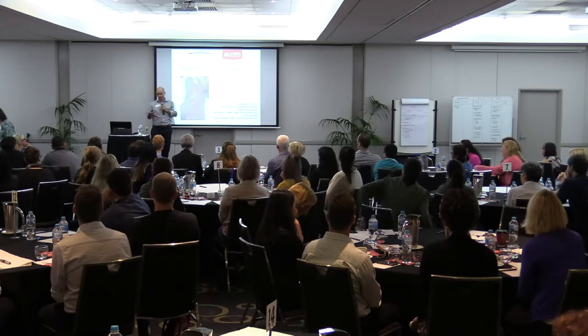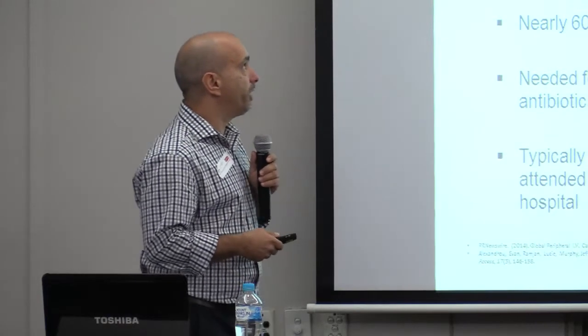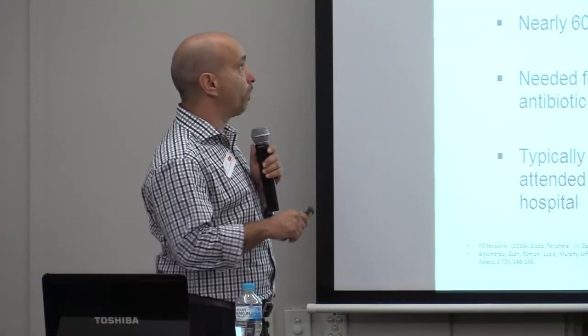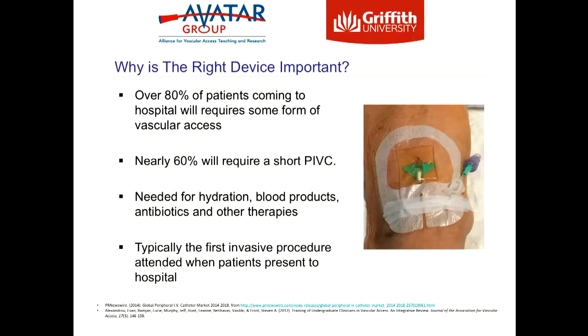Okay, so we're going to talk about pretty much what was resonating in a lot of the table discussions, and that's about the right device for the right patient. About 80% of all patients that come to hospital will have some type of vascular access device. Predominantly, however, from admission, they're usually a short PIVC. Whether that's the most appropriate device or not can be debated, and we know from the chats that we have that potentially it's not the most appropriate device.